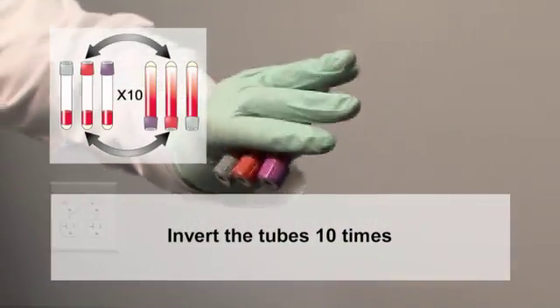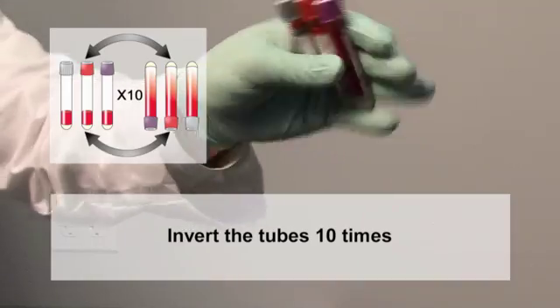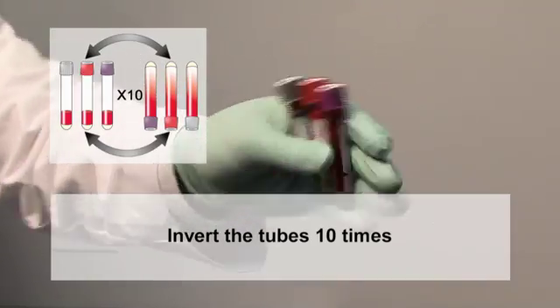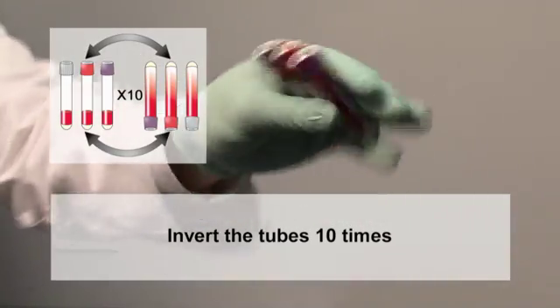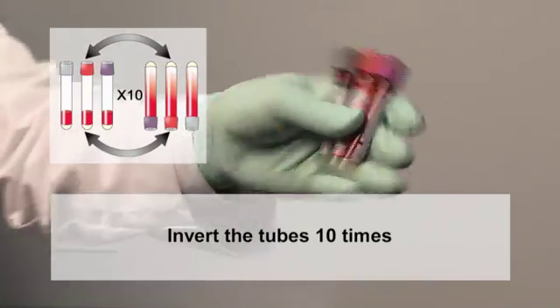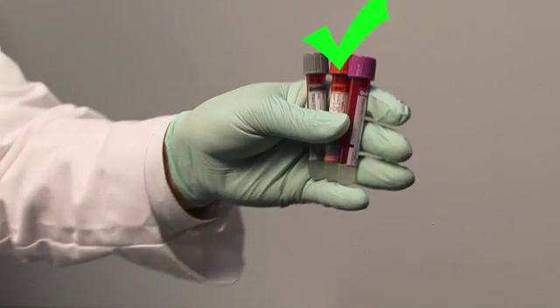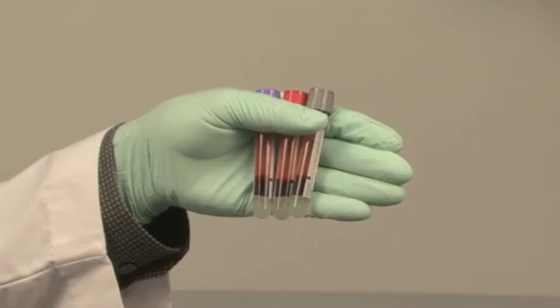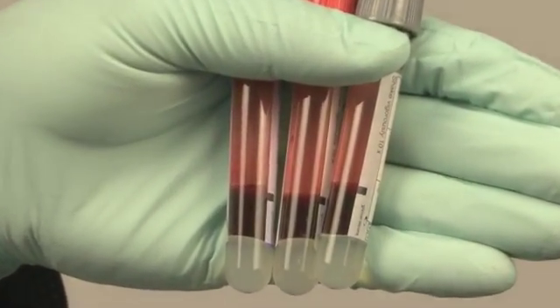This is achieved by inverting the tubes 10 times, as demonstrated here. Proper mixing will ensure that the entire inner surface of the tubes is coated with blood.